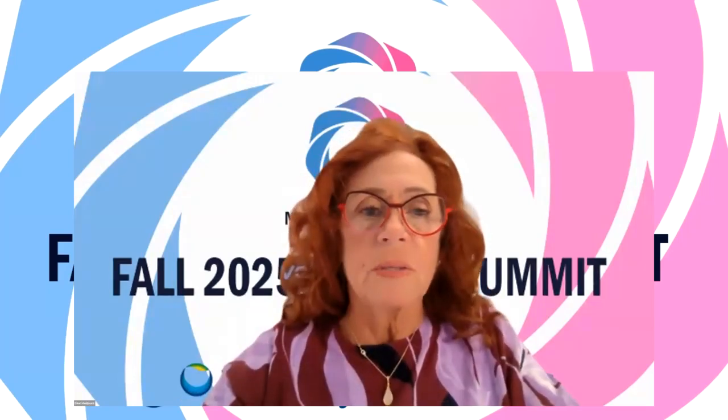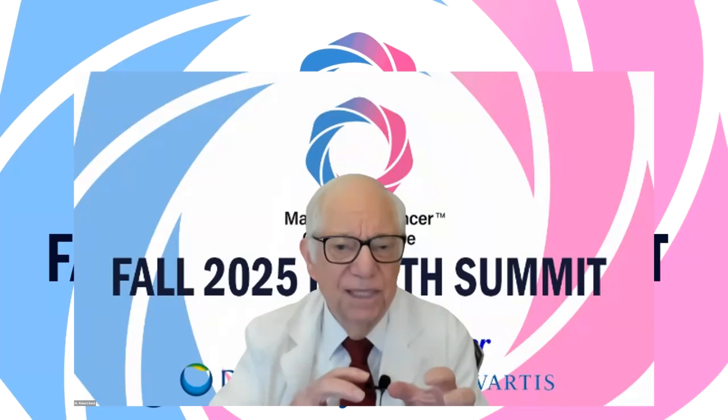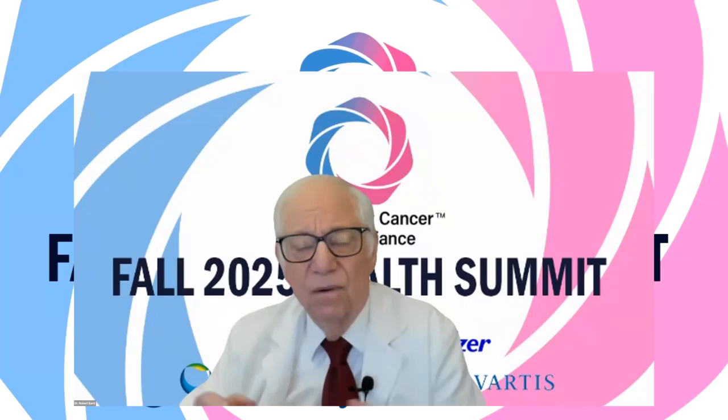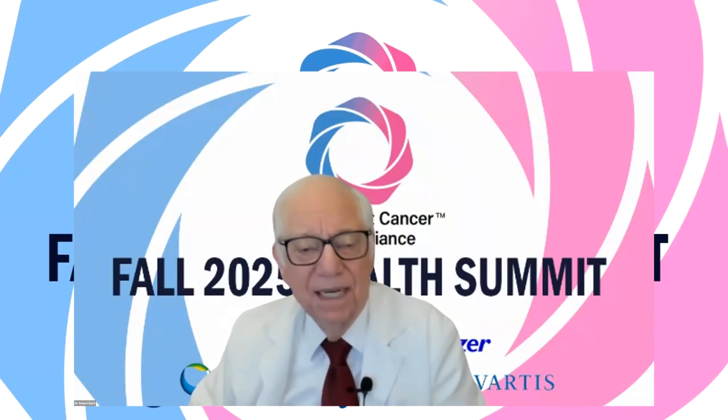So the ultrasound is actually a little bit more effective, you would say? It's not only ultrasound, it's ultrasound, blood flow technology, elastography, focal thermal imaging on the area. So all these are combined to reassure doctors and their patients that this is probably not serious.